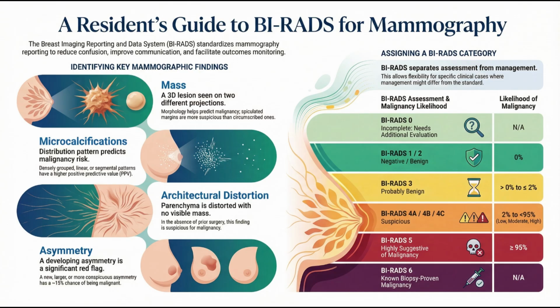Exactly. And it really is the essential dictionary for this field. Its power is all in the standardization. The BI-RADS lexicon, the current one, the 5th edition, gives this really consistent framework for every single finding. So it stops one doctor from saying "a weird spot" on a report. Precisely. The goal is to stop that exact thing. It gives them a precise universal language so everyone's on the same page.